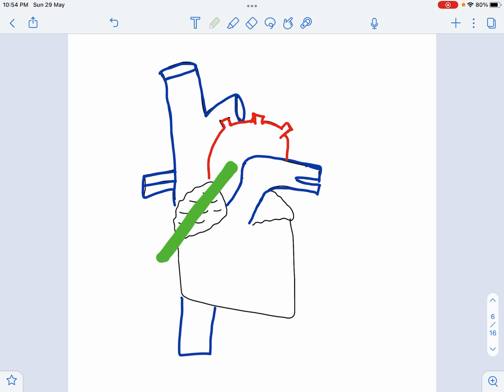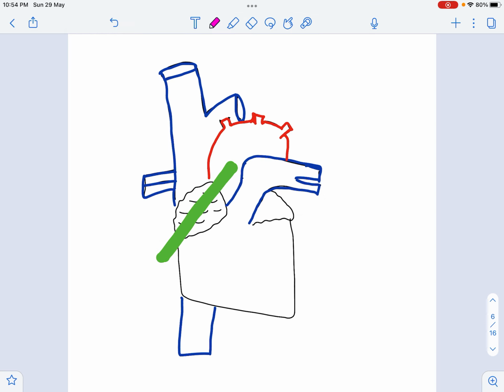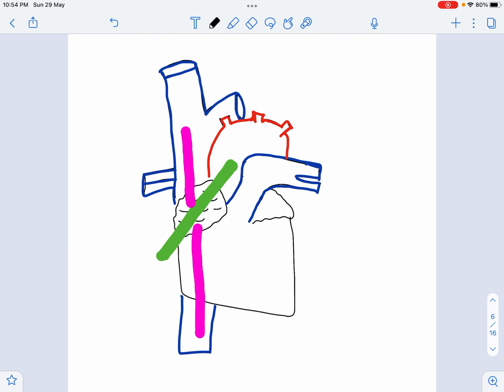All right, and we have also cannulated, what color do I use? We have also cannulated the vena cava. So basically, now what is the function of the heart? This is very basic physiology. Blood enters from the vena cava into the heart, and the heart pumps it out via the aorta and the pulmonary artery. The pulmonary artery will go to the lungs.